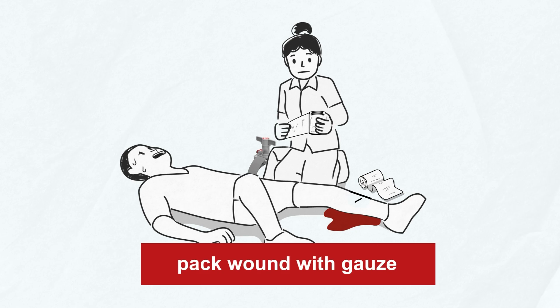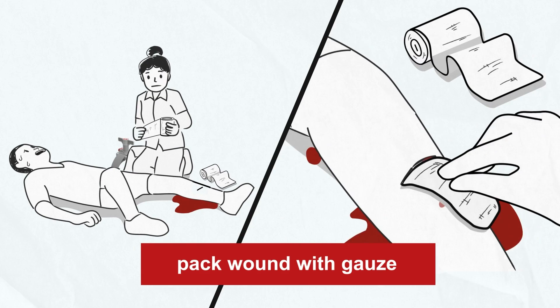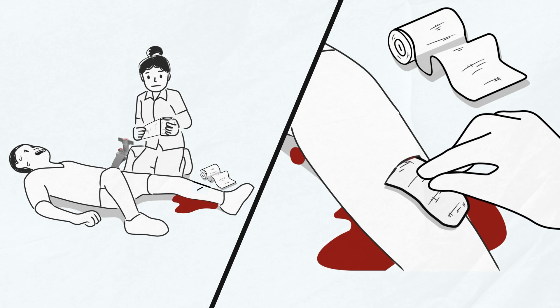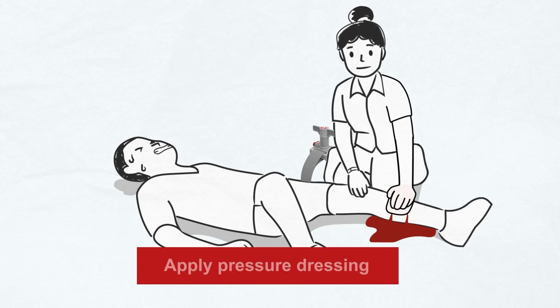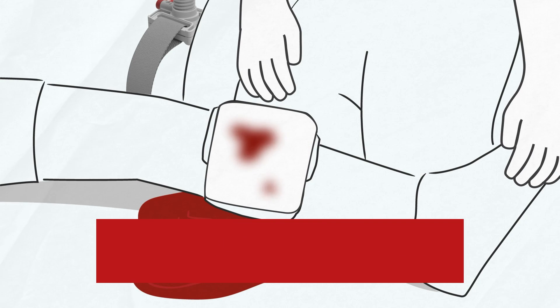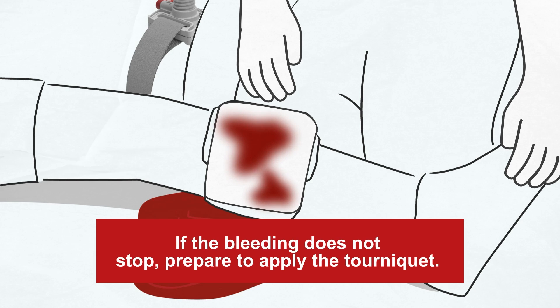From your bleeding control kit, pack the wound fully and tightly with the wound packing gauze. Maintain firm direct pressure. Then apply a pressure dressing and hold firmly in place while using constant direct pressure. If the bleeding does not stop, it is time to apply the tourniquet above the wound.